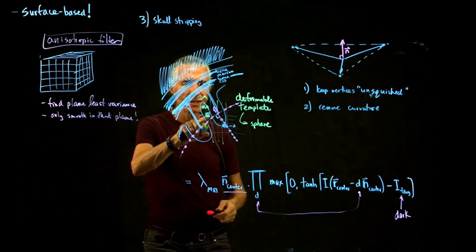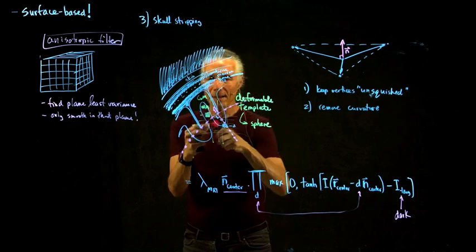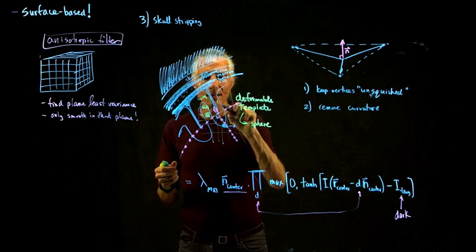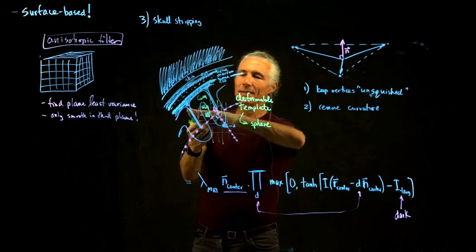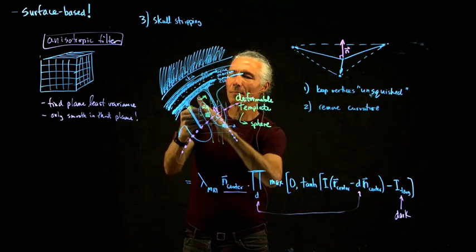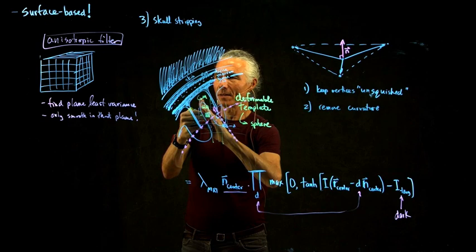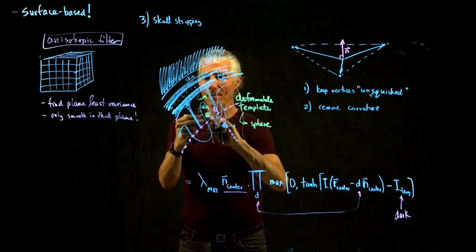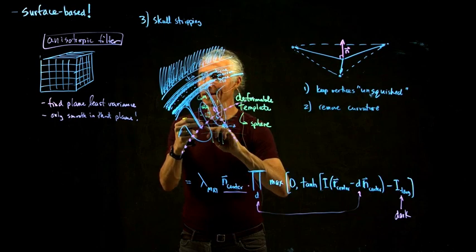So how would that fix this voxel? Well, it would take a little chunk of 5 by 5 right here, and then it would say, oh, I detect a plane in this direction. And so I'm going to smooth in that direction, and then that will smooth it with some other white matter voxels, and it would kind of get rid of that little bad guy.